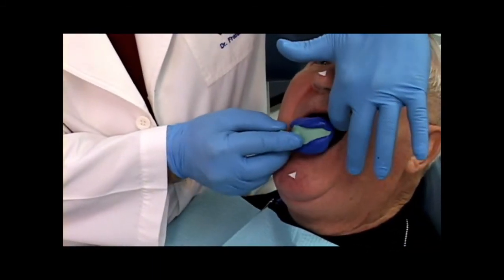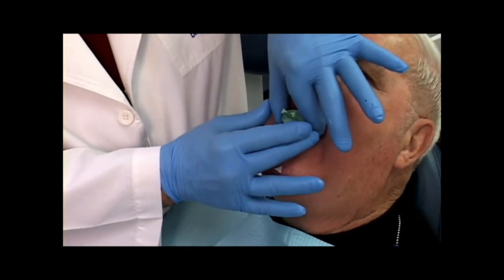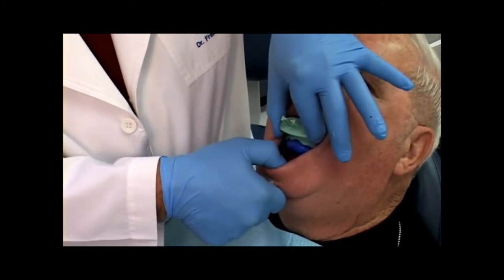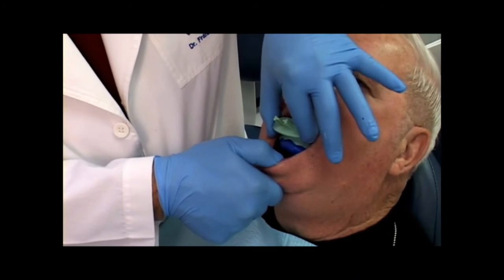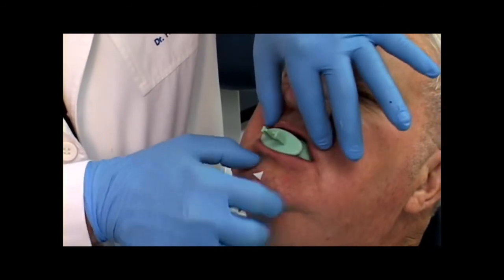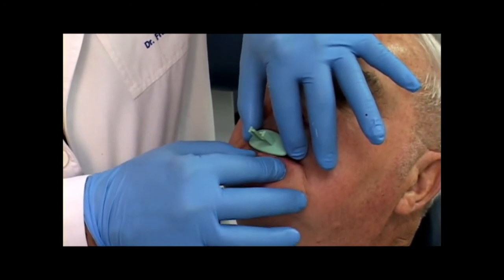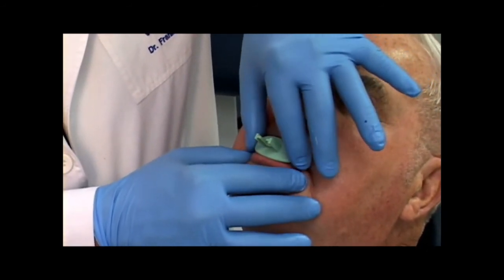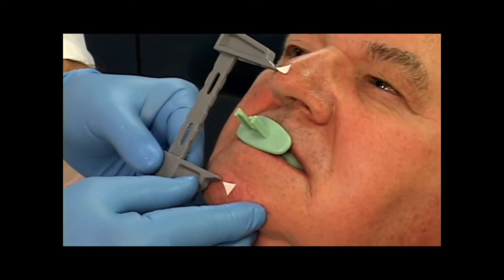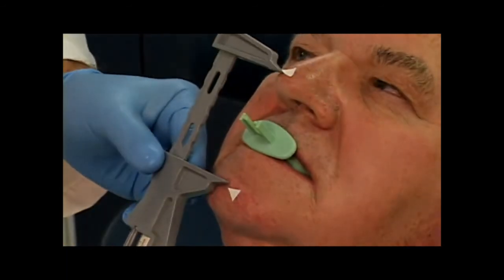Insert the loaded centric tray. Stabilize the tray over the maxillary ridge and support the tray with one hand. This frees up the opposite hand, which can now chin guide the mandible closed. The patient's lower lip must be pulled forward so that it does not fall into the registration. The patient is asked to relax while the dentist chin guides the mandibular ridge into the registration material. The lips are relaxed and allowed to rest against the lip support of the centric tray, while the dentist checks the vertical dimension with the previously made vertical assessment.